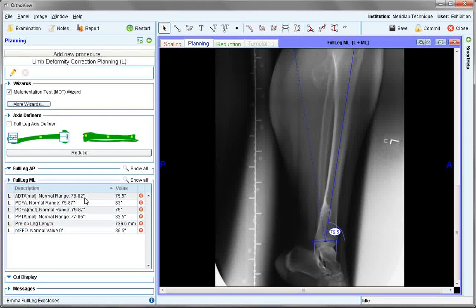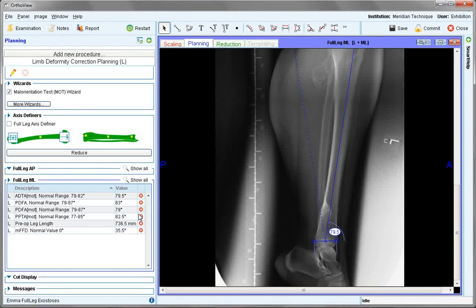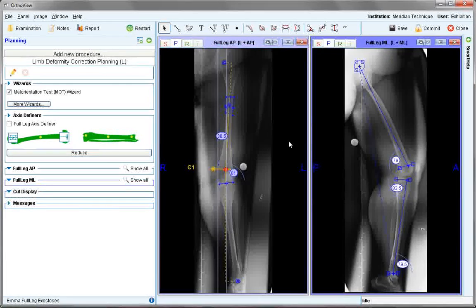The measures for normal range — the values shown by positioning the MOT wizard — are all represented in the report, and anything outside of the normal range is highlighted in red. As per the AP, we now can apply axis definers.